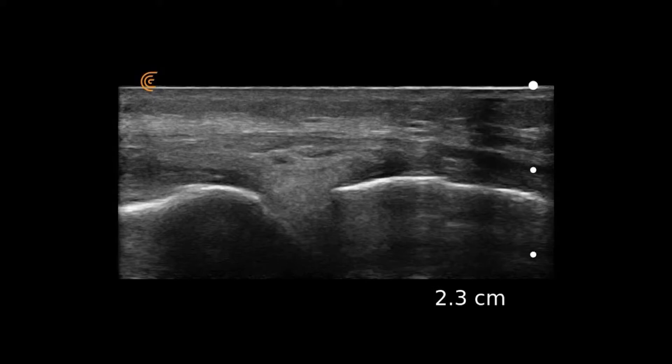This is a scan with a linear transducer in a longitudinal orientation placed right at the knee joint. Here's the femur, here's the tibia.